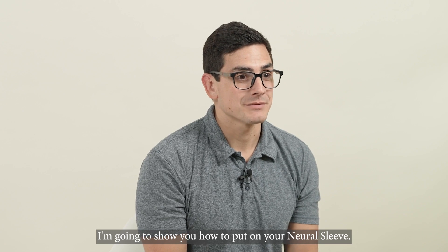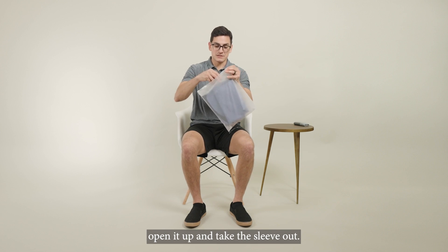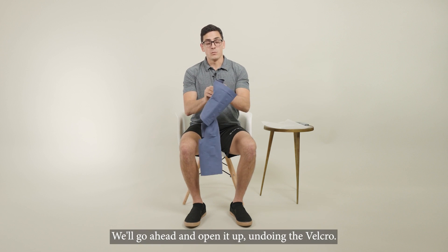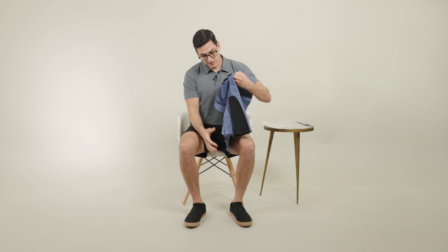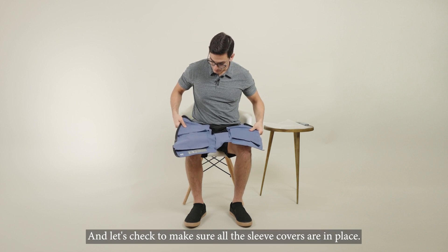I'm going to show you how to put on your neural sleeve. First thing we're going to do is take the storage bag, open it up, and take the sleeve out. We'll go ahead and open it up, undoing the velcro.